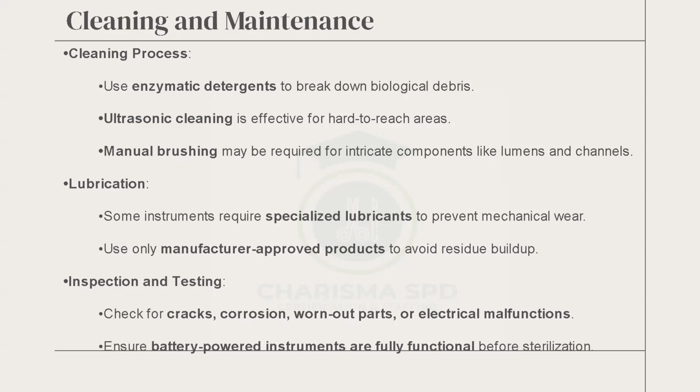Ultrasonic cleaning is effective for hard to reach areas. So yes, but you have to follow the IFU of the instrument. If it is not supposed to go into the ultrasound, you don't do that. If it is supposed to go into it, it will be stated.